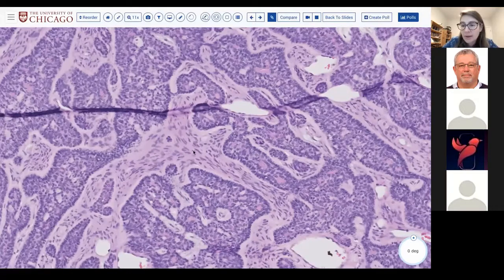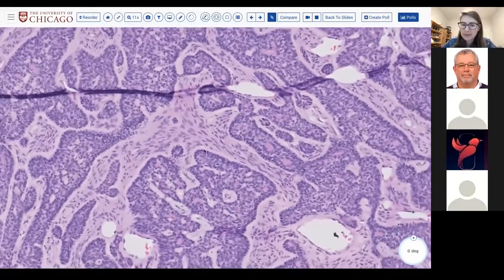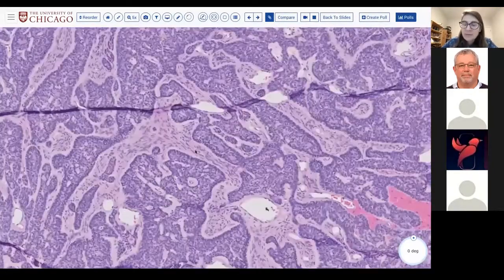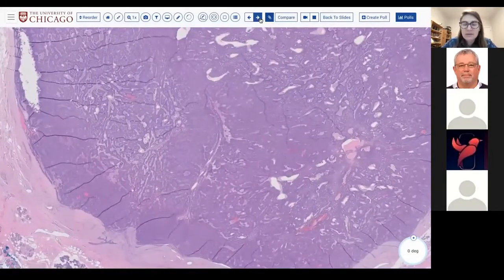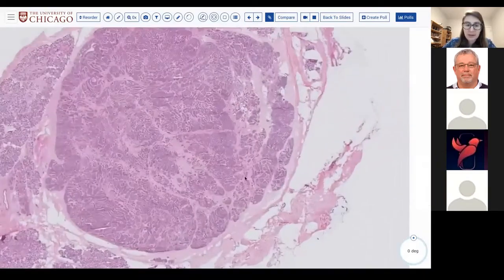And I think this is quite characteristic, and I like to use this combination of the tubulotrabecular, the eosinophilic globules, and the stroma together to make a diagnosis of basal cell adenoma. And I think this is very characteristic. And so in contrast, I just wanted to show you an example of a very similar neoplasm that was also sent for frozen, as you can see here.